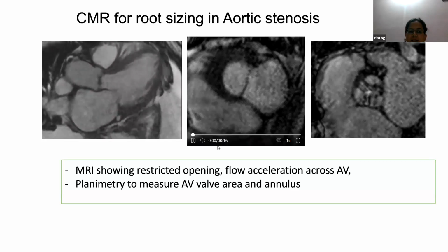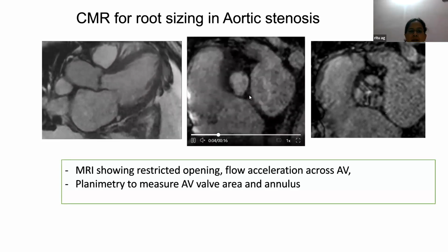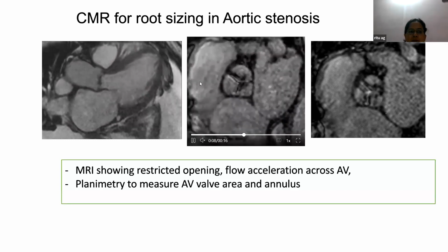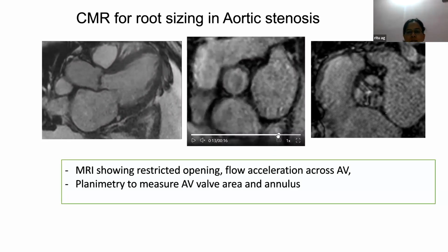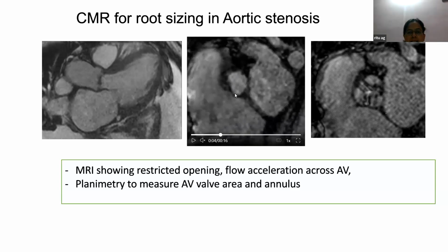Now these are the actual images through the same patient. So we are going down, I'm sorry, we are coming up, like going from below upward. So I'll run these images once more. So here, that is somewhere below the annulus. This is the annulus. This entire thing is the annulus.